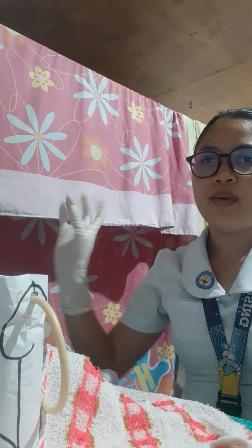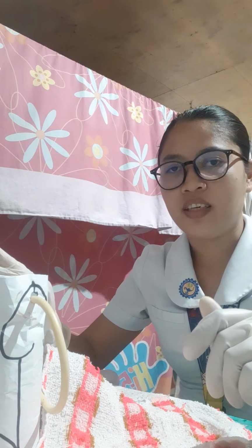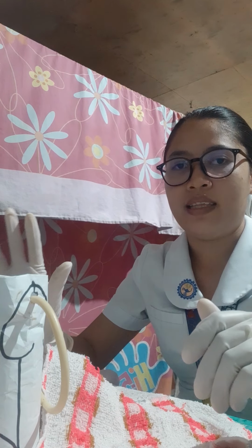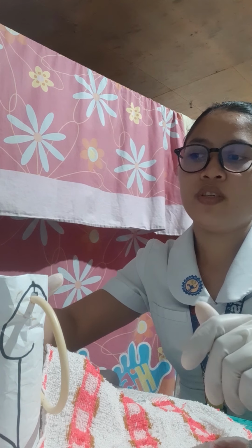Next, with the non-dominant hand, we are going to gently retract the labia majora for a female client to fully expose the urethral meatus. Then the catheter insertion site, maintain position throughout the procedure. While in a male patient, we're going to retract the foreskin of an uncircumcised male client and hold the penis shaft below the glans, maintaining this position throughout the procedure.